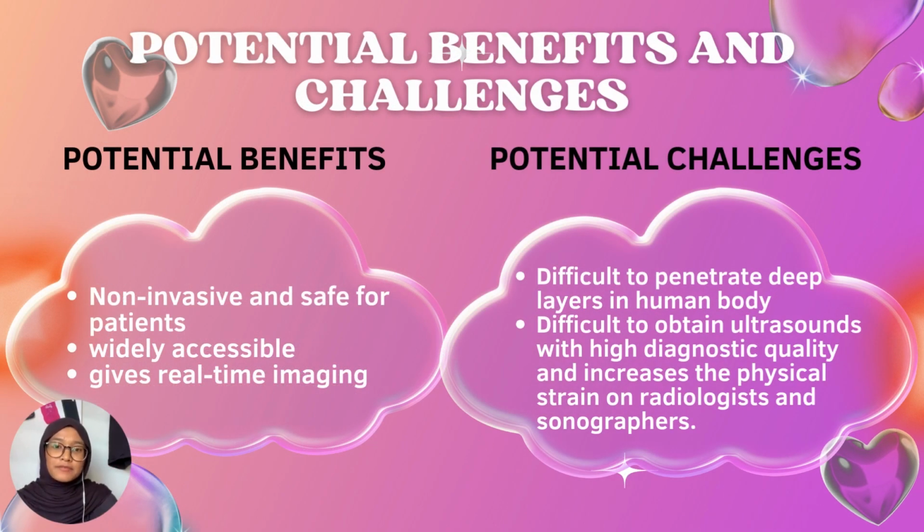There are many benefits of ultrasound, such as it is non-invasive and safe for patients, widely accessible, and gives real-time imaging. Ultrasound is non-invasive because it does not need any needles or injections. It is safe for patients, especially for pregnant women and fetuses, because ultrasound uses sound waves, so there will be less risk and no harmful effects.